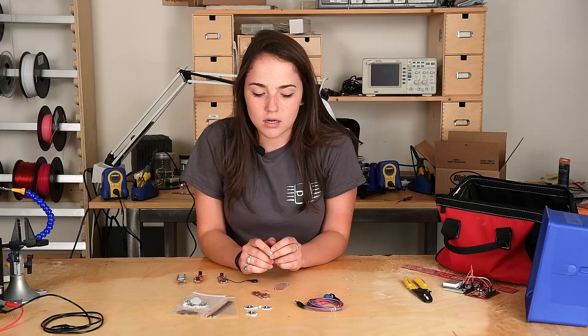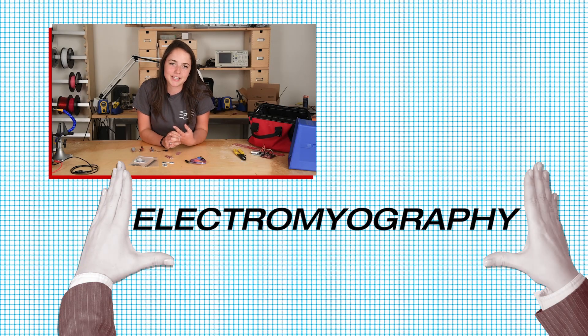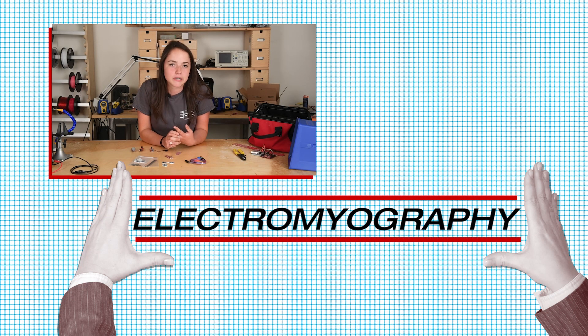Being a biomedical engineering student, it's easy to become fascinated in electronics that are integrated with the human body, and that's exactly what this kit does. Included in the kit are electrodes that collect an EMG-type signal — electromyography, if you're unfamiliar — which collects the electrical impulses in your muscles.